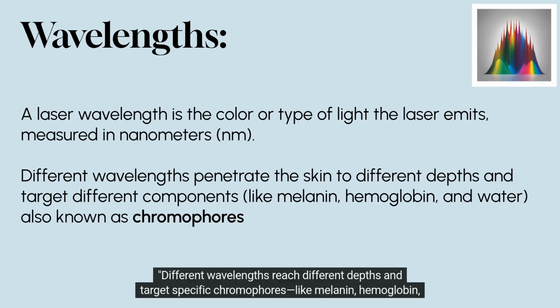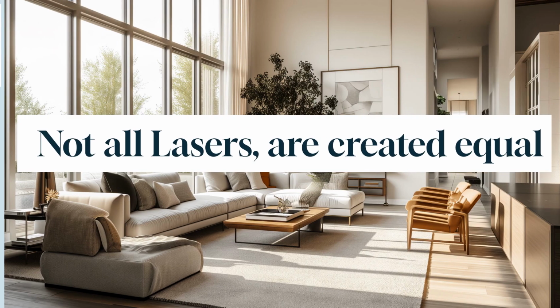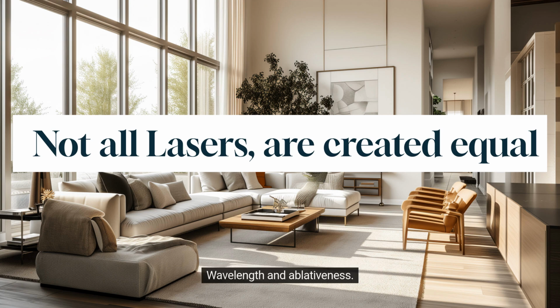Different wavelengths reach different depths and target specific chromophores like melanin, hemoglobin, and water. Understanding this is key to selecting the right laser for the job. Lasers are powerful tools in aesthetic and medical treatments, but not all lasers are created equal. One of the most important differences? Wavelength and ablativeness. Let's break it down.